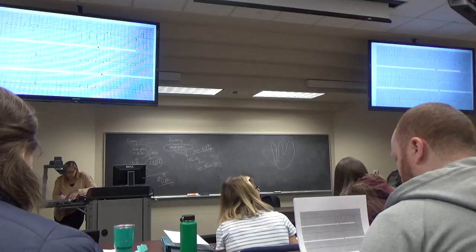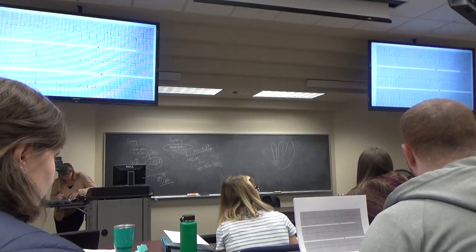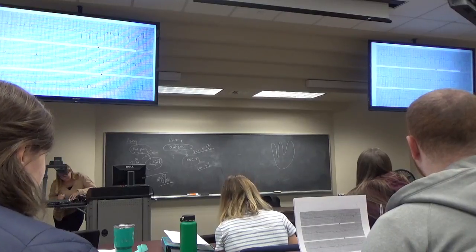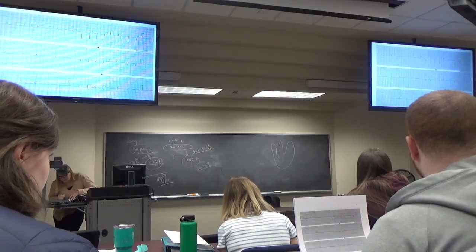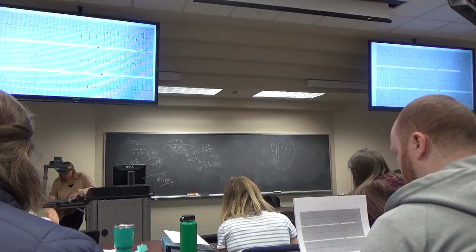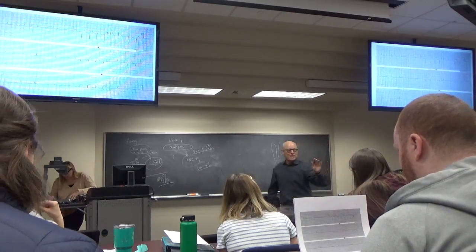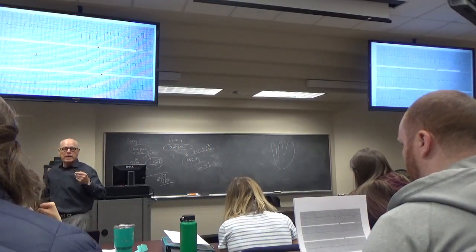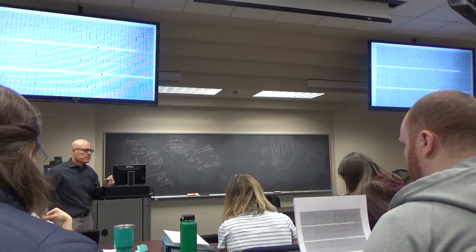Remember now, listen carefully. Jacob would have called this an MI too. Well, he wouldn't, because he wouldn't have missed what's actually on here. But he looks at those and says, look, there's tombstone in V1, V2, and V3. This is a heart attack. Get him to the cath lab. That's what he would say, because he's an ER kind of cardiology kind of guy. He doesn't want to miss an acute MI.